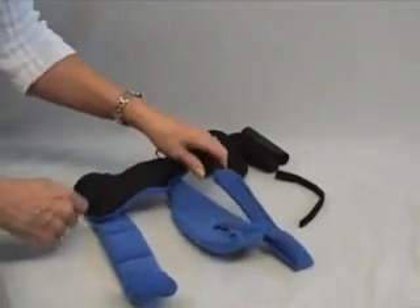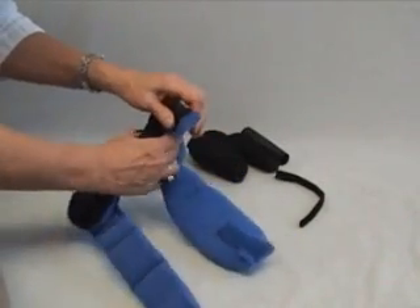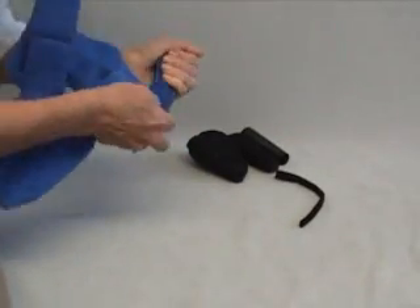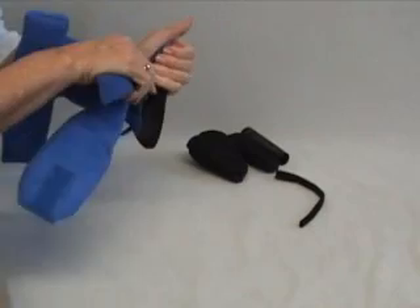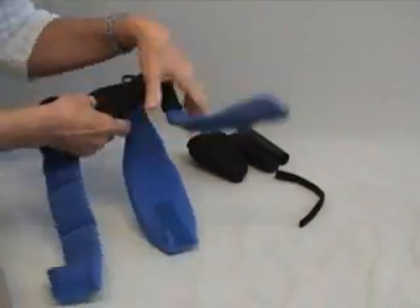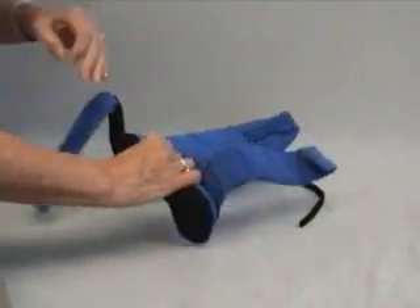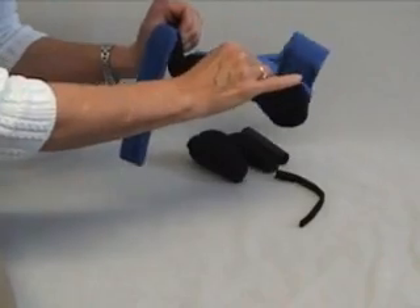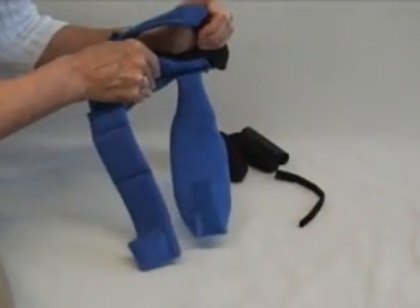The way to don this for a very tight fist, you can either fold this back and start to work it through, very gently slide the strap around. I tend to hook your fingernails of your patient underneath and roll it up into the fingers.